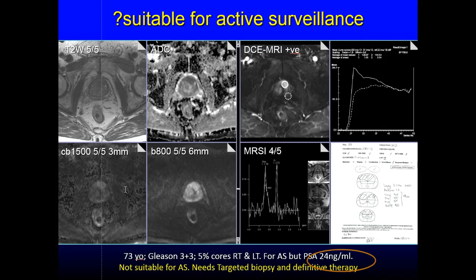So that puts him at high risk despite his biopsy score only being 3+3. Now clearly he's at high risk, there's no doubt about it. He's got a big cancer sitting there in the front of the gland. But you can see how that thought process prompted an MRI, prompted the diagnosis of a tumor that was not known about anteriorly in the gland.